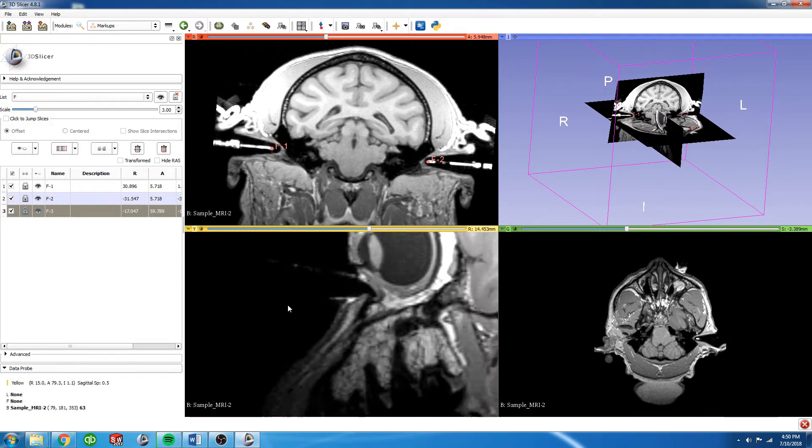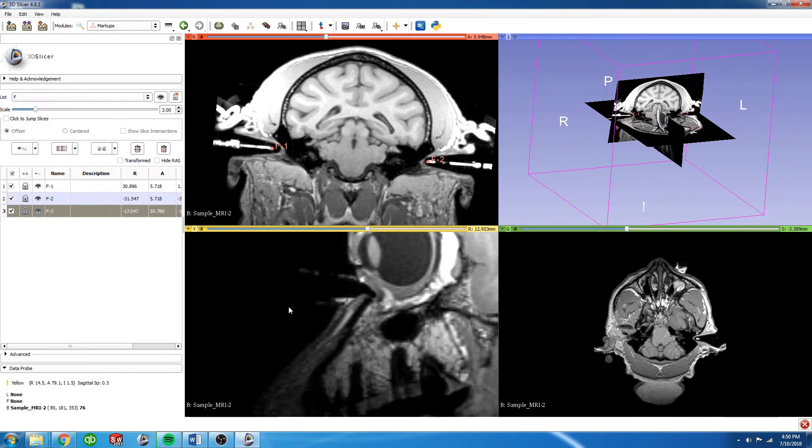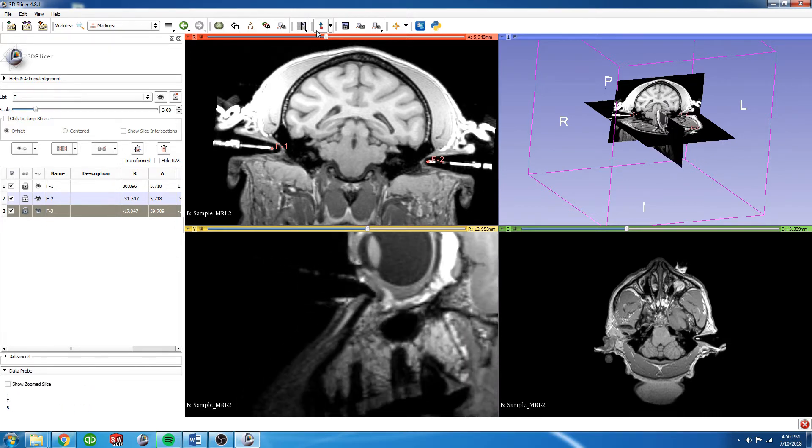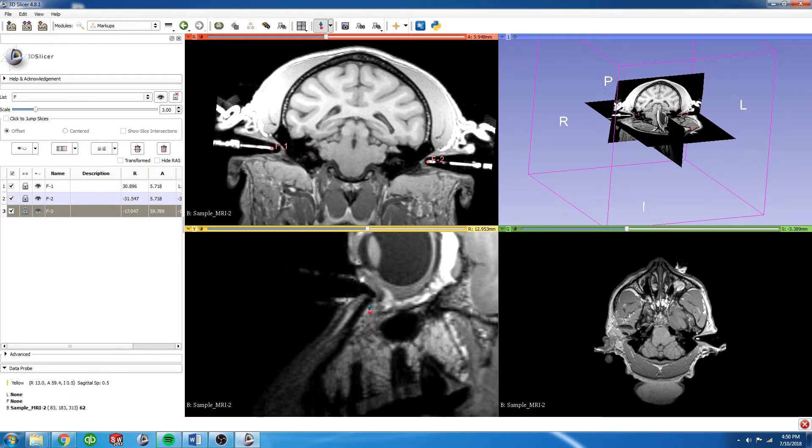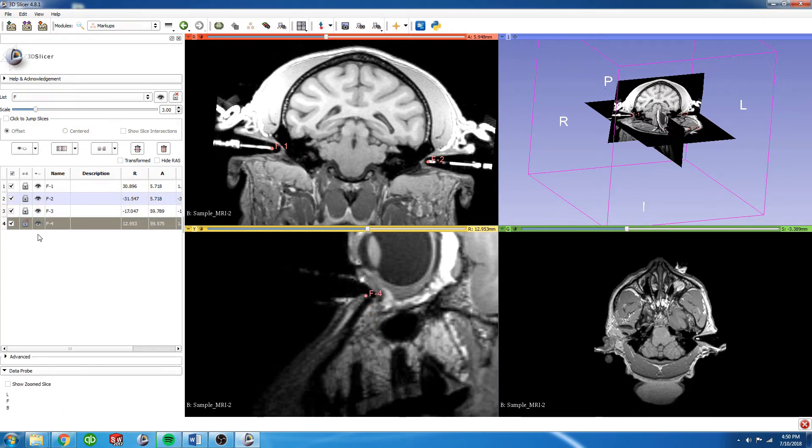There's the eye bar. Find the center of it by scrolling back and forth, and then fiducial at the top of that bony ridge, lock it.